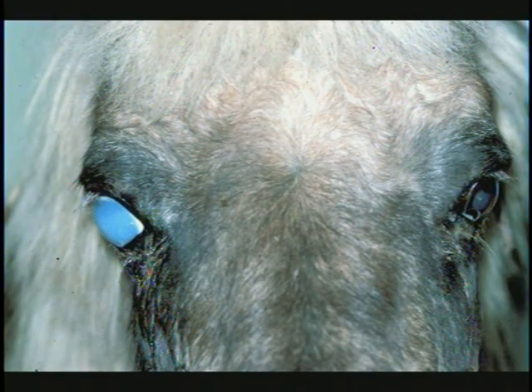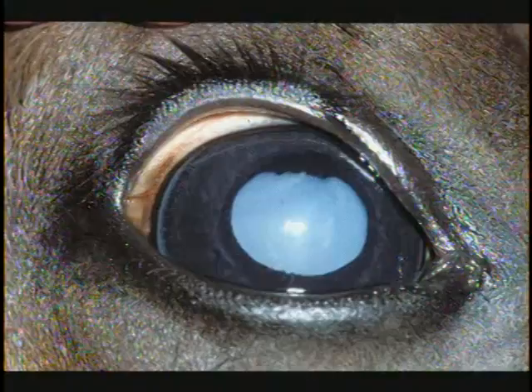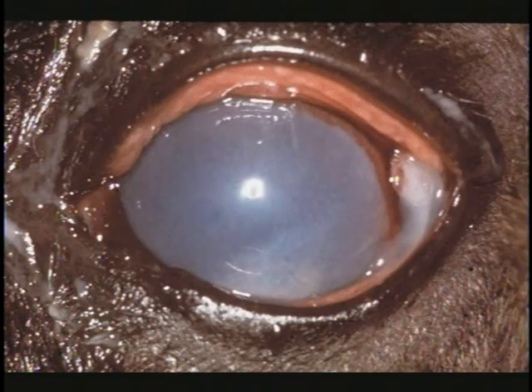Equine glaucoma in recent years has received much attention and has increased in the frequency of diagnosis solely due to the availability of the Tono-Pen and the increase in the number of equine eyes that are evaluated. In addition, horses with cataract or equine recurrent uveitis should have intraocular pressure determined.